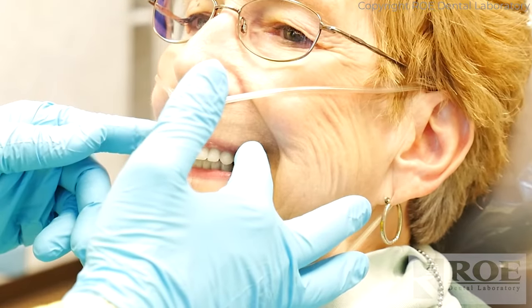We may have a little bit of fortune with the bottom. You have multiple bites — that's normal. You can bite on the back, and then you can slide forward. You can go back. Try to bite down now. Take any bite you want. Do you see how you did that? Then you went forward because you can do that.